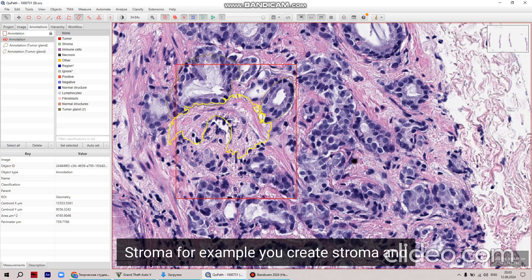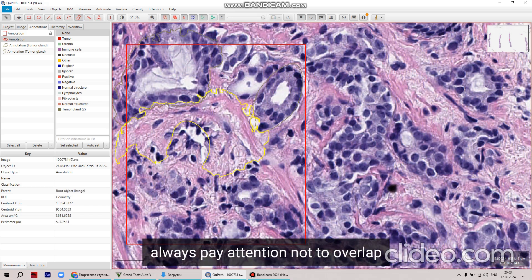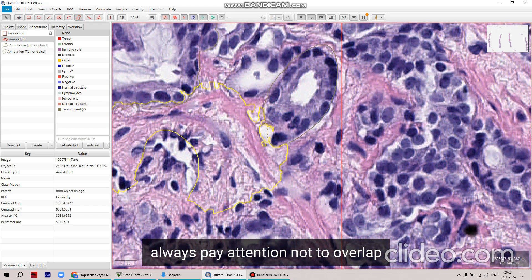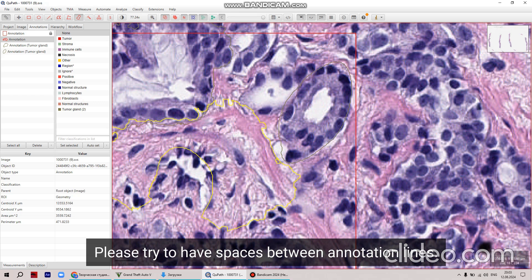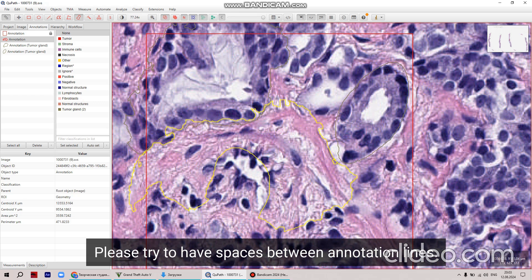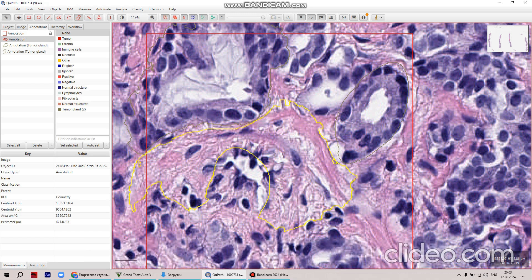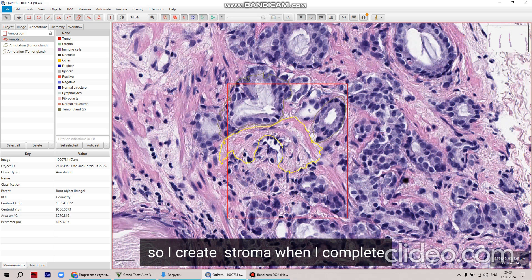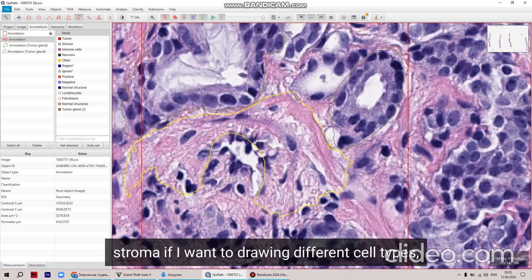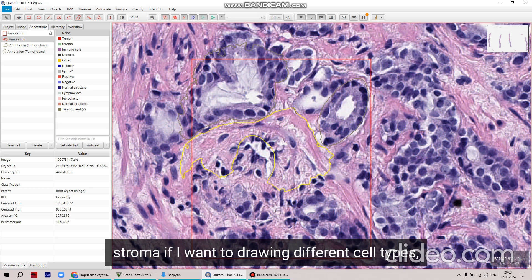You simply drag and drop the SVS image to the main window of Kupath. After that you see the question 'What type of image is this?' and you select 'Brightfield H&E' and click. Then you apply and you see the prostate cancer core biopsy.